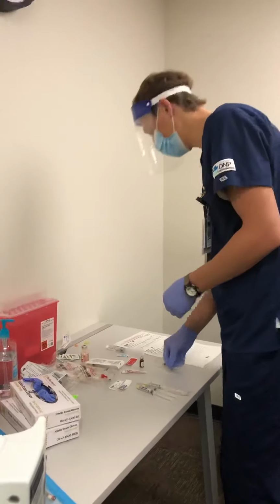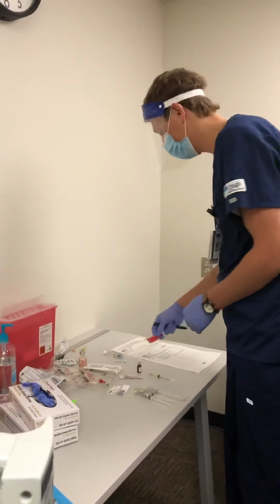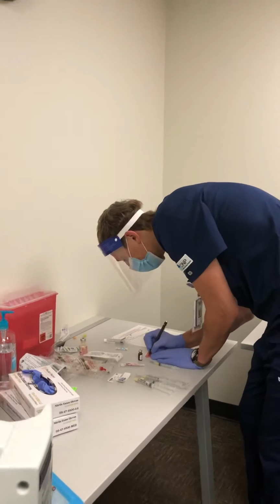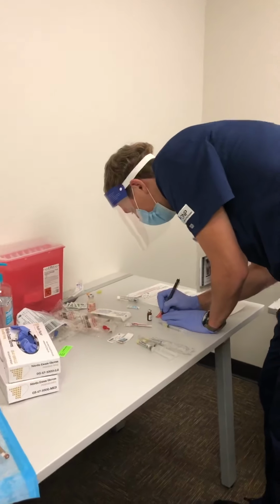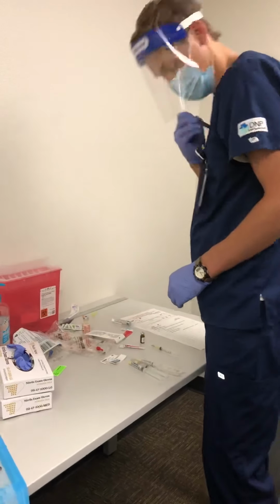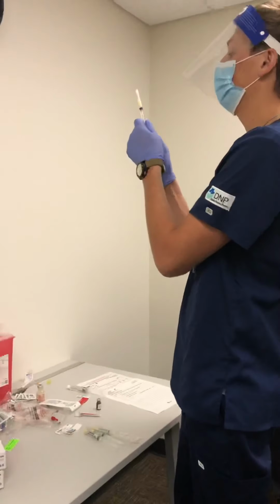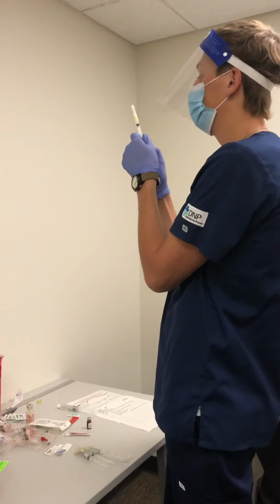Okay, and while that's there, I've got that ready. I'm also going to write the medication label here, so I'm going to have my 0.4 mL of morphine. And that's the only information that needs to go on that label. Okay, so I'm going to go ahead and pull my 0.4 here.